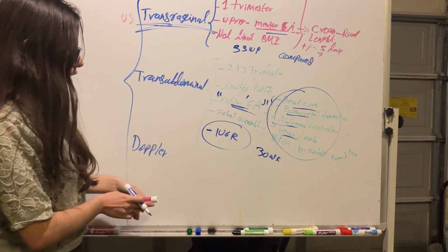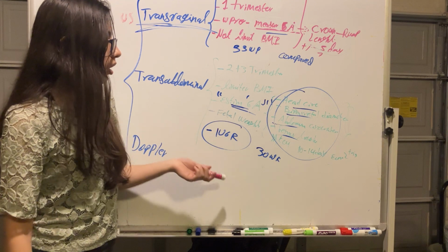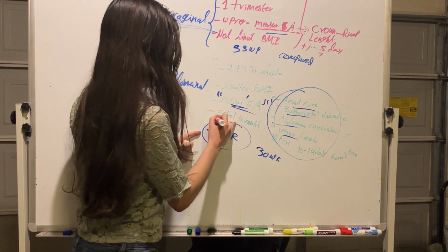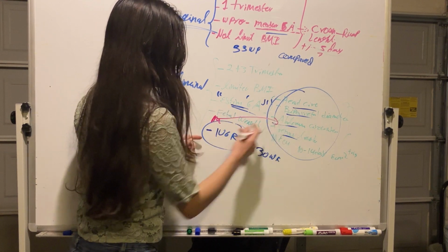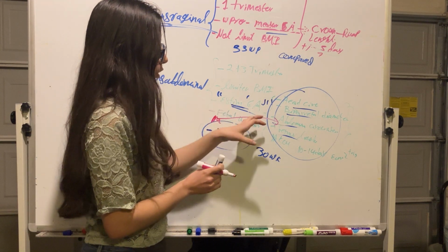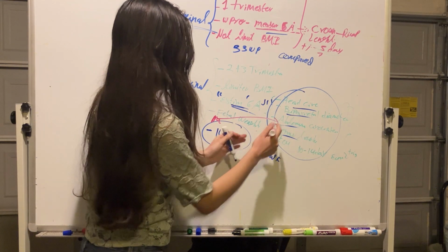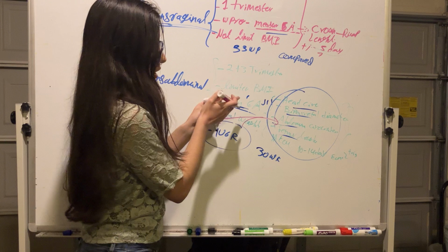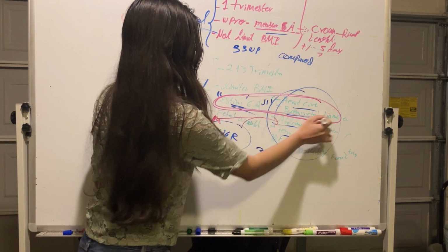And the fetal weight, this also is going to give us a clue for intrauterine growth restriction. The fetal weight is measured based on the abdominal circumference. The most important predictor of fetal weight is the abdominal circumference, as opposed to what is most predictive of estimated gestational age, which is head circumference and biparietal diameter.